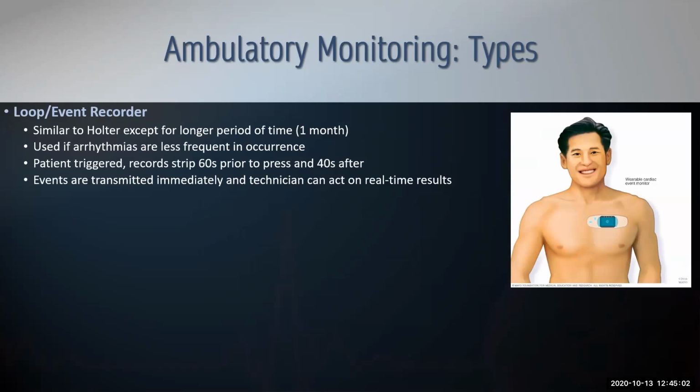I don't know, honestly, much about the technology, whether the triggers are on the device itself. Some of them are now on cell phones that can connect to the device so they can then correlate it. And then it goes to a central command center where they can find out what that rhythm is.